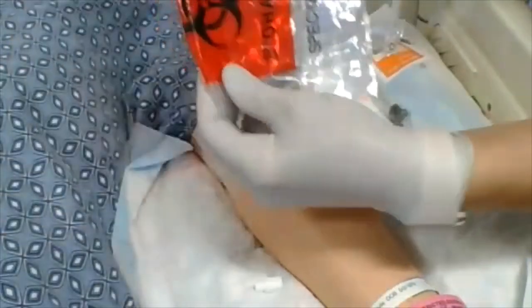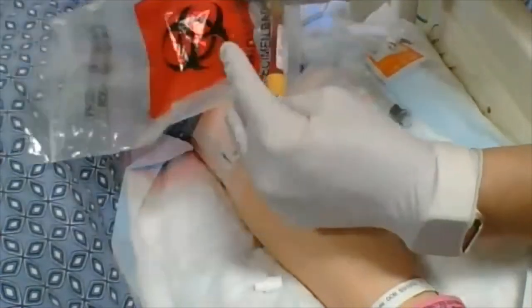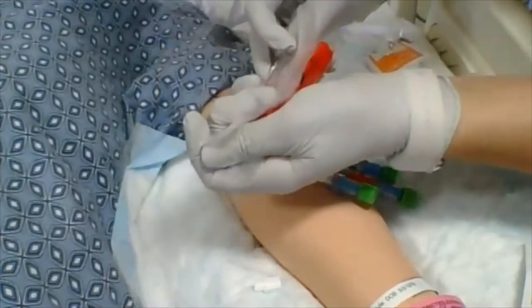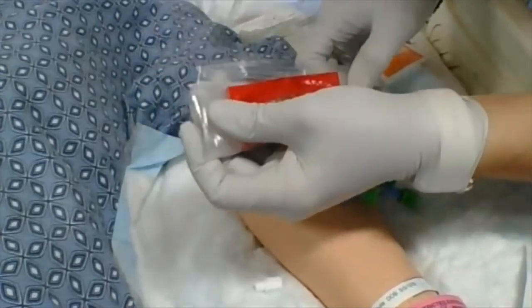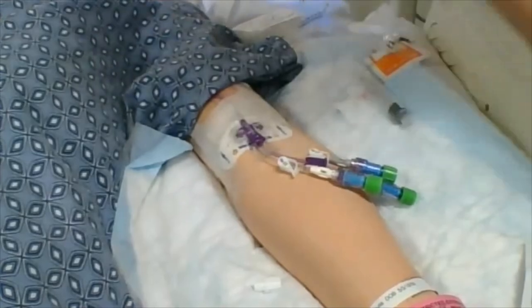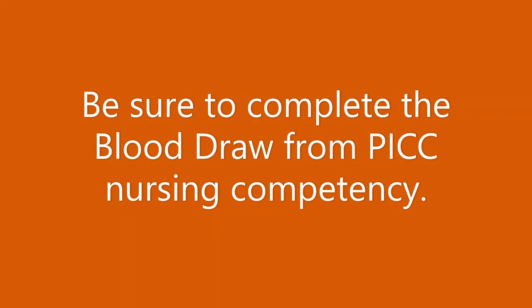I have my tube, everything's flushed, everything looks good. I have my biohazard bag and the tube goes in — I can put this in the pneumatic tube to send down to the lab. If you're curious about the order of blood draw tubes, just refer to the blood collection tube guide. If you're not sure what to flush these pigtails with, we also have the IV flushing guide. That's it — hope you enjoyed it and found it helpful. Thank you.